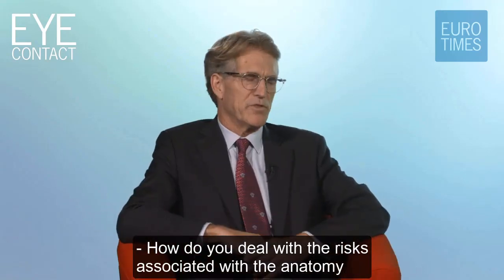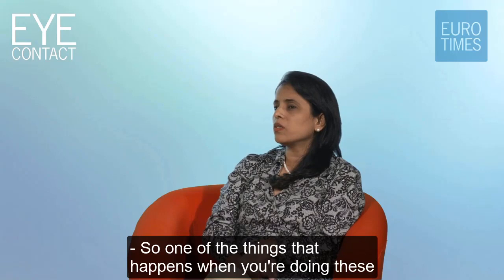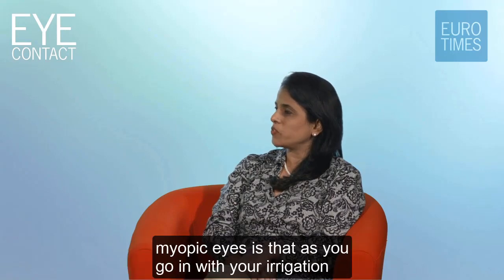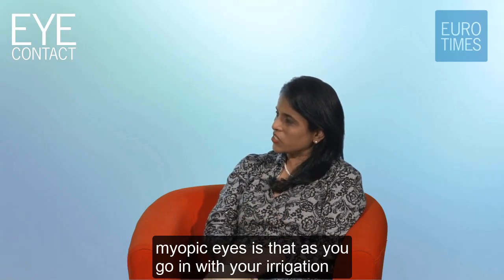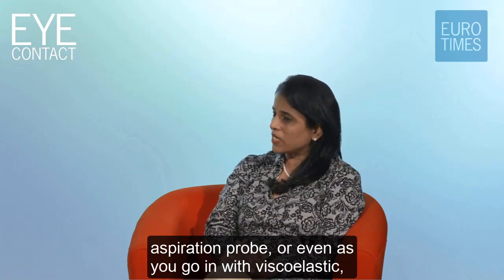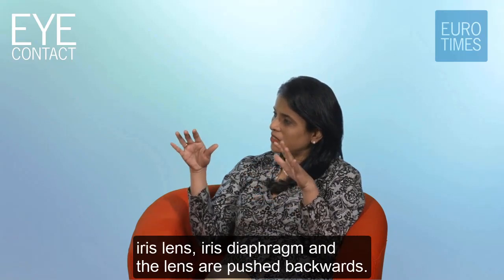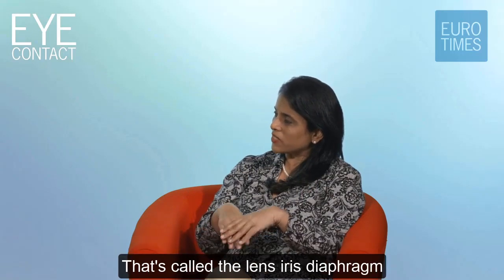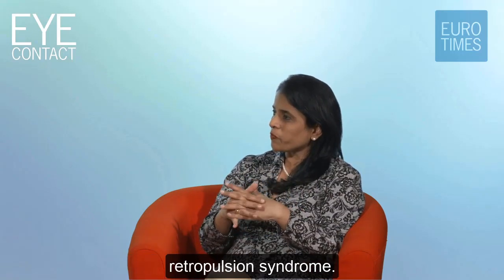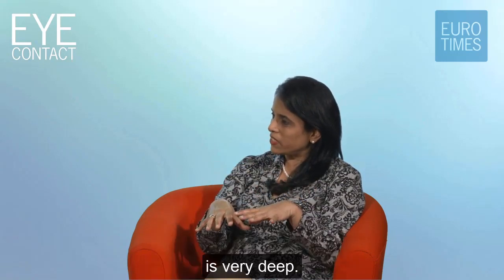Absolutely. How do you deal with the risks associated with the anatomy of those eyes as you're getting ready for surgery? So one of the things that happens when you're doing these myopic eyes is that as you go in with your irrigation aspiration probe, or even as you go in with viscoelastic, the entire equator expands, the zonules expand, and the iris diaphragm and the lens are pushed backwards. That's called the lens iris diaphragm retropulsion syndrome. And what happens is that you get this reverse pupillary block. The whole anterior chamber is very deep.